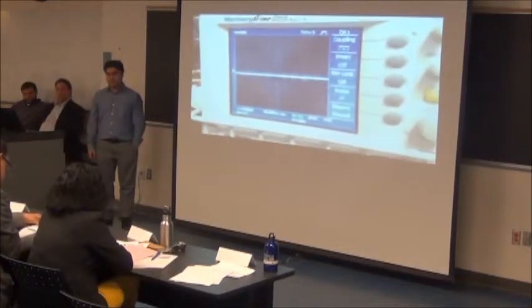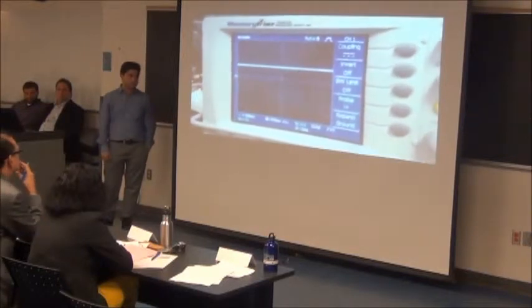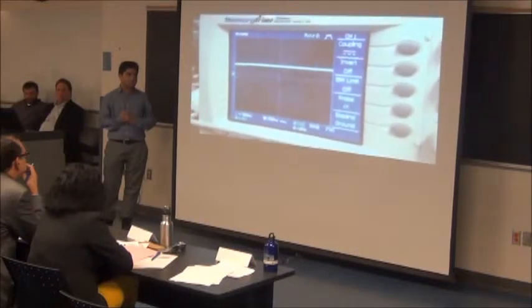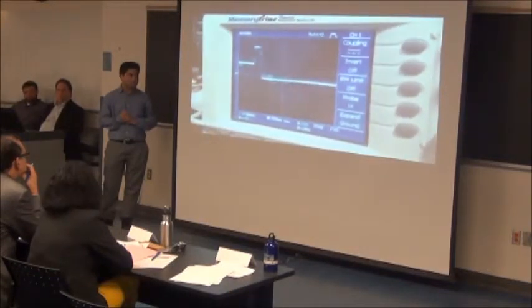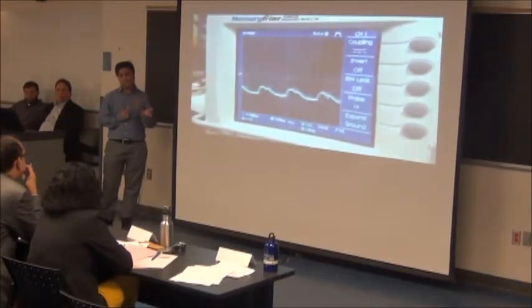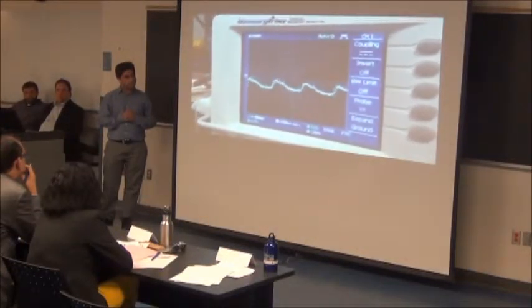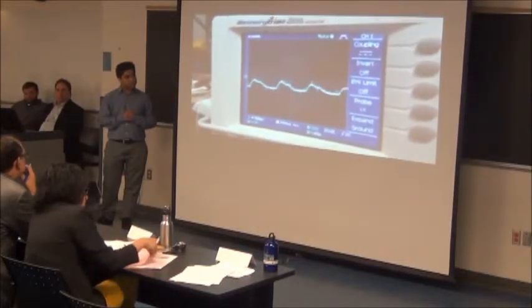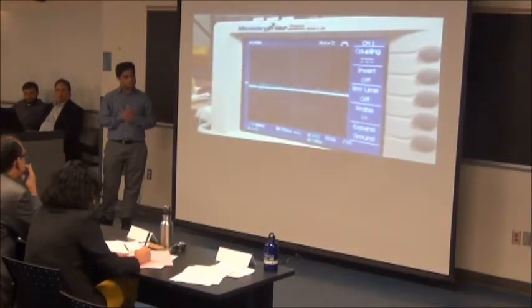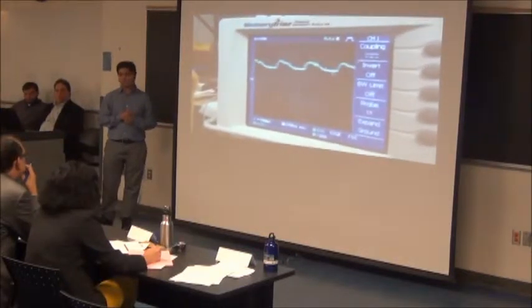And then we're going to change the static levels. So we're going up, and then we're going to auto zero it. There we go. Auto zero. And then we're going to put the waveform in. Zero the waveform, zero it down. And now we're going to do a static zero, auto zero it, and now go to the waveform. 120/80. Perfect.